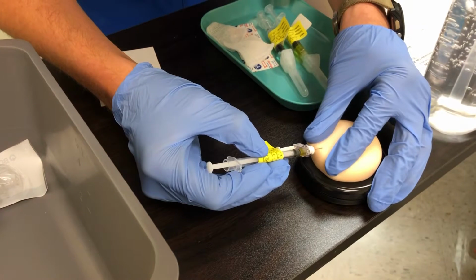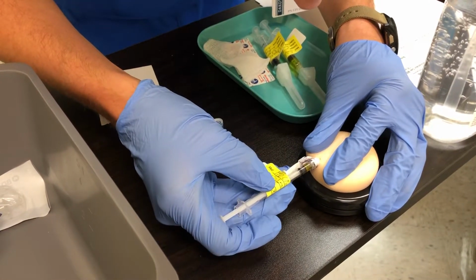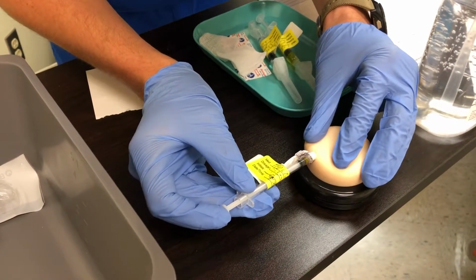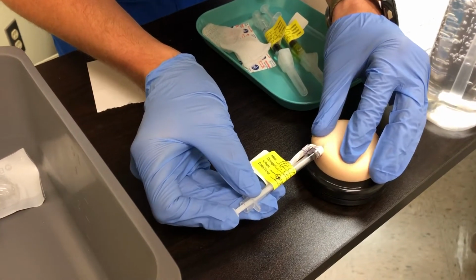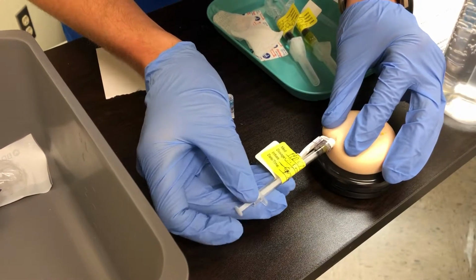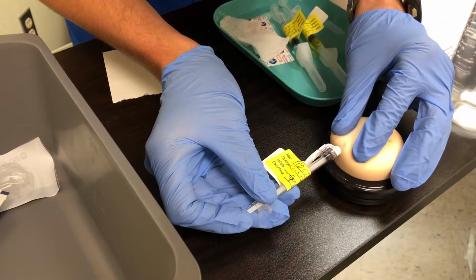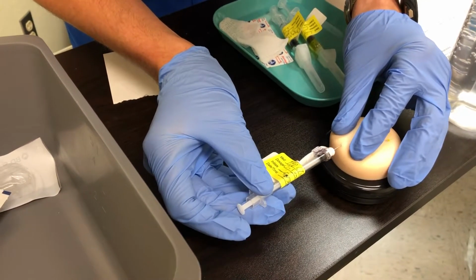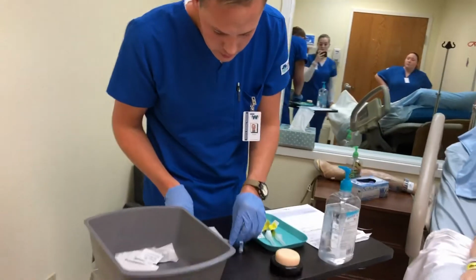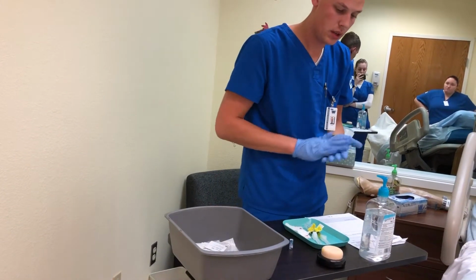1, 2, 3. Okay. And then we're going to go in with this just to try and make that. And then we're going to cap it. And so that one's done.